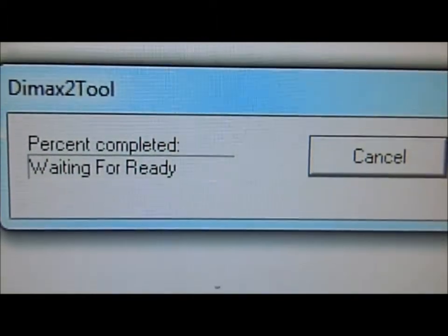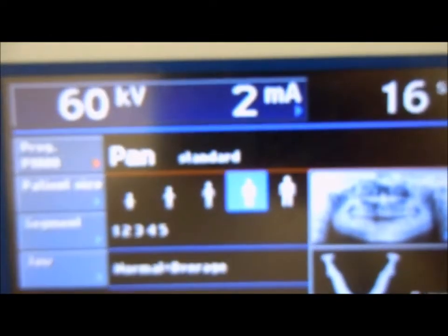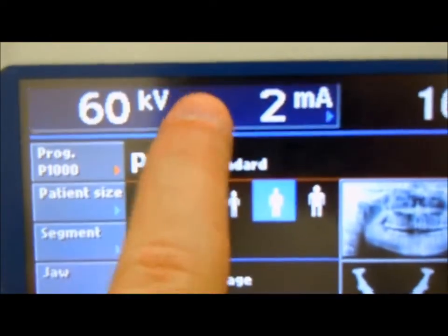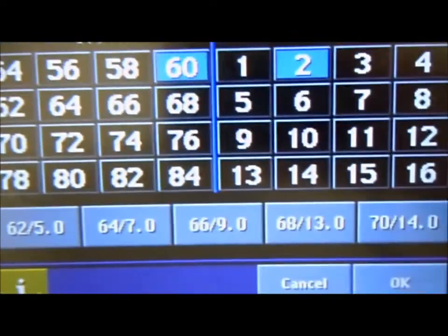It's waiting already. Now we go to the display here. Make sure our KV is set to 60 and our MA to 2. Change that and press this button and select the different settings, and press OK.